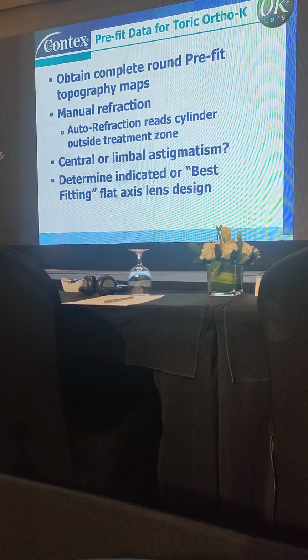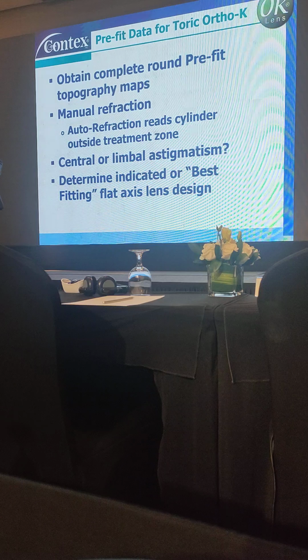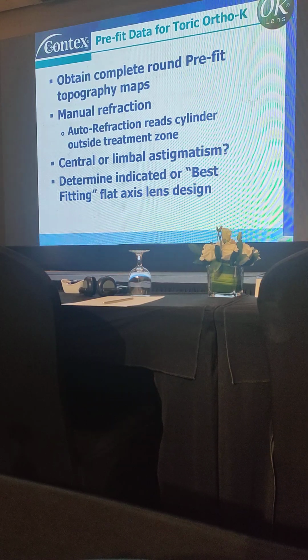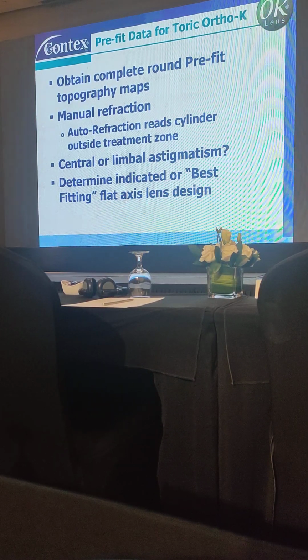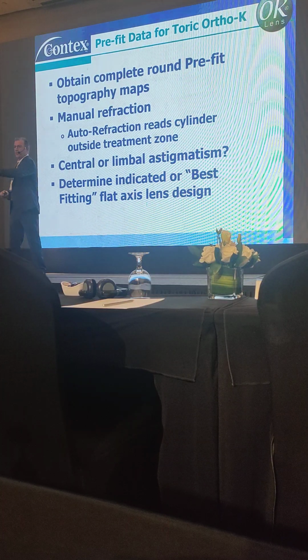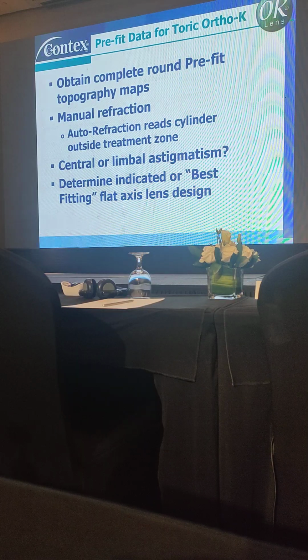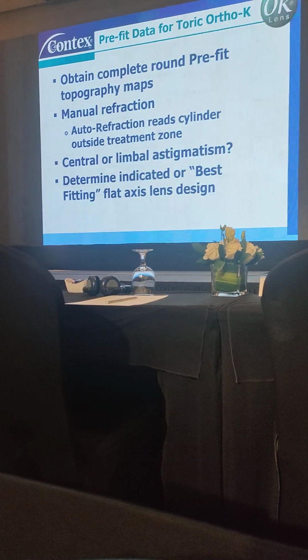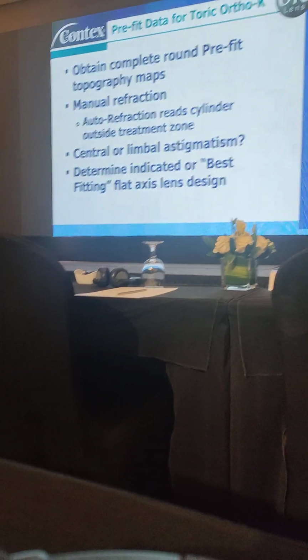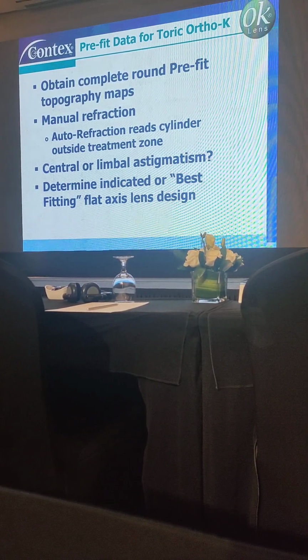So you might get a patient that's seeing 20/15, perfect vision, and your autorefractor says plano -6 because you have a 6 diopter steeper reverse zone where the tissue has built up. So it's very important when you follow up with these patients that you do a manual refraction. Do you guys both agree with that?